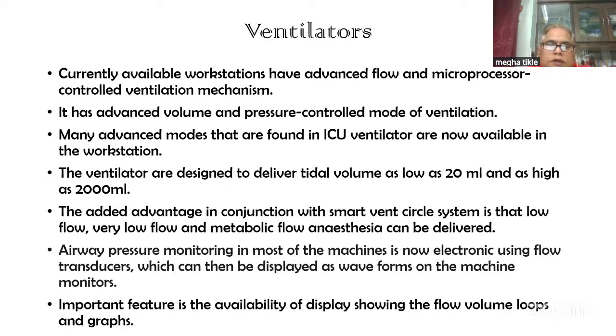Now, it consists also of a spirometer and an airway pressure monitoring device, with the flow sensor transducer. So all the information that is there is displayed as a waveform on the machine monitor. And important data is shown as either loops or graphs on the display of the ventilator.